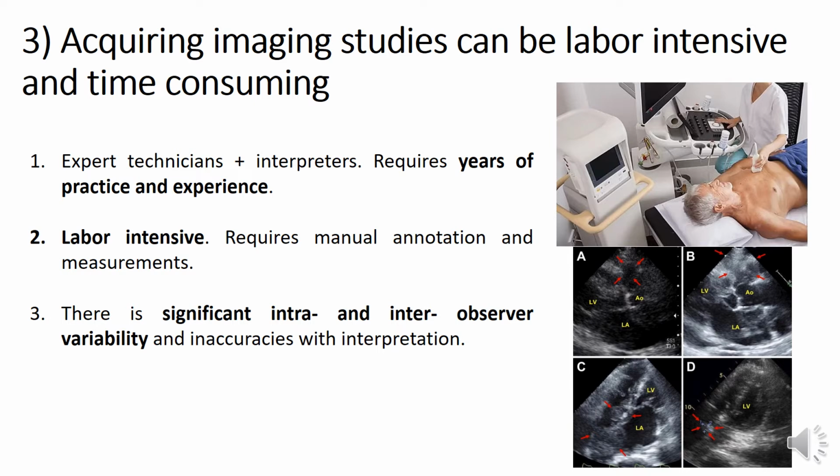Thirdly, acquiring imaging studies can be labor-intensive and time-consuming. In order to acquire a scan, it requires extensive technical and interpretation expertise, which by itself requires many years of practice and experience. Scans are also labor-intensive, and other than scanning, they often require manual annotation of structures and determination of measurements. In addition, there is significant intra- and inter-observer variability when imaging studies are interpreted.